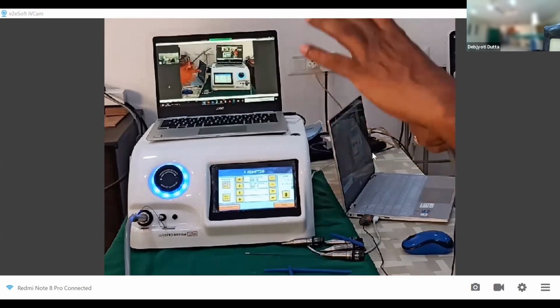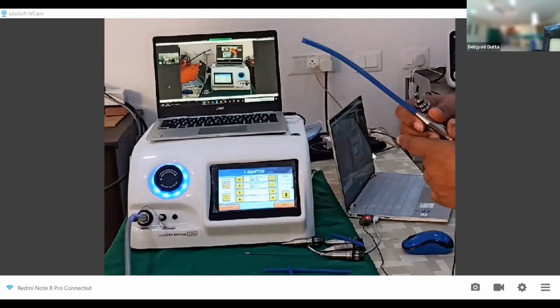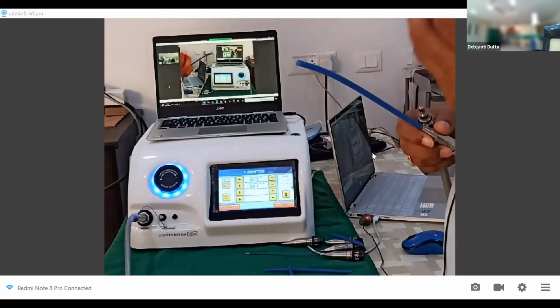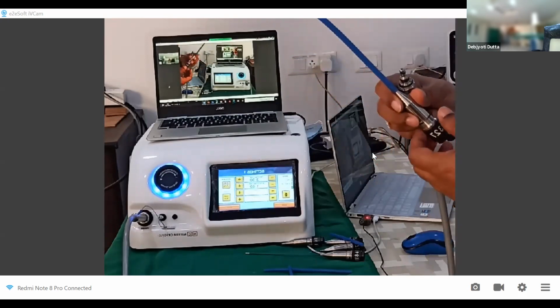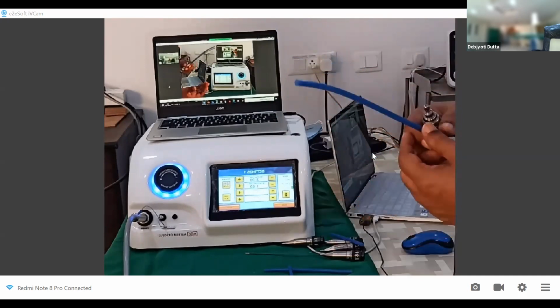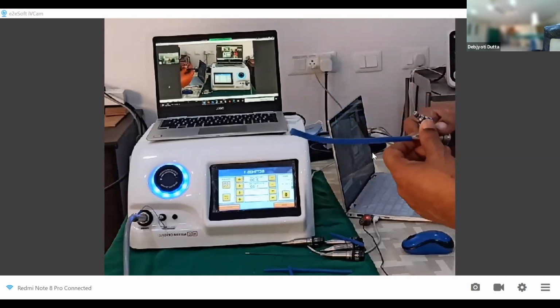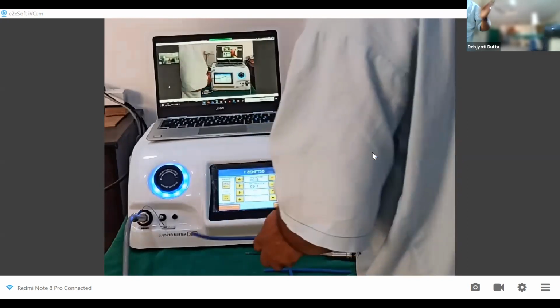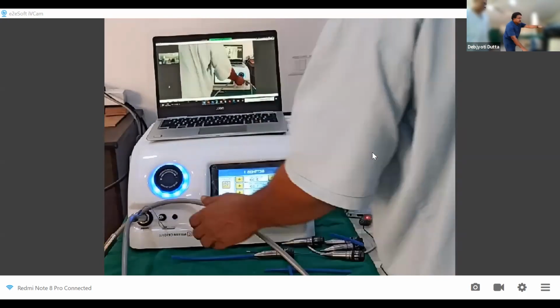Advantages, I told you, the large size lesion. And as we are telling, a large size lesion in cooled radio frequency has the advantage. In the same way, the cryo can produce an even larger size lesion than the cooled RF is doing. So this is a little bit about the cryo, and then we'll be showing you the machine of the radio frequency.